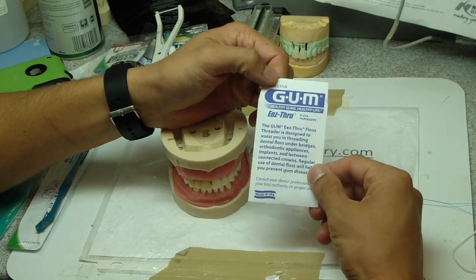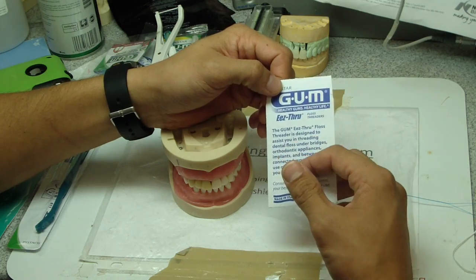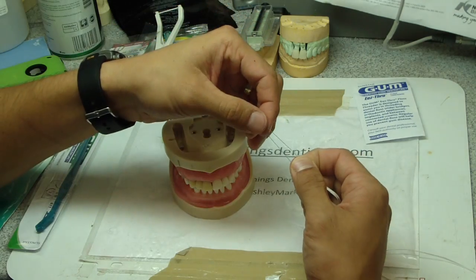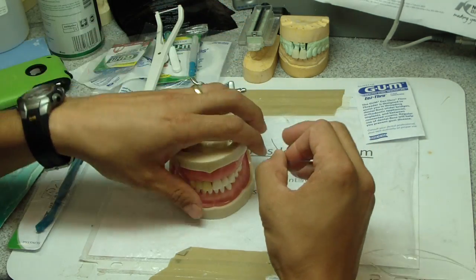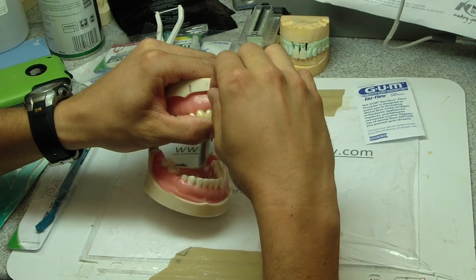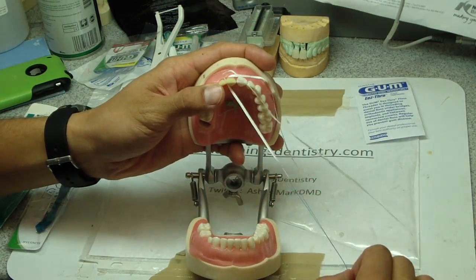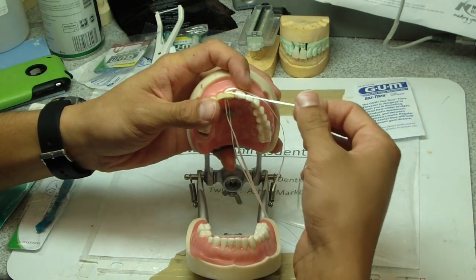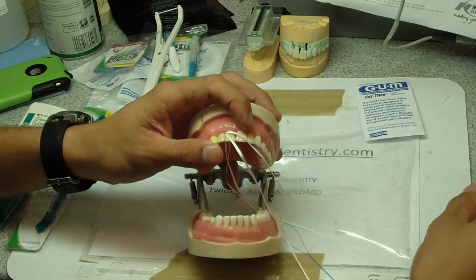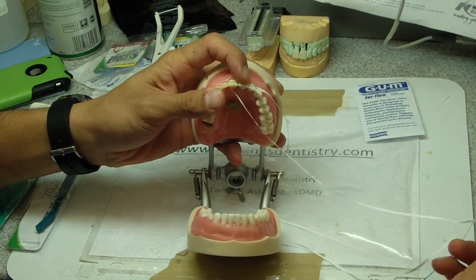We're going to go price-wise, cheapest to most costly. So the first one is a floss threader. It's essentially a piece of fishing line, a little thicker, and you thread this through below apical to the proximal contact — through where the pontic is. Pull it through. You can use Glide or probably better just regular floss. Use whatever you've got.